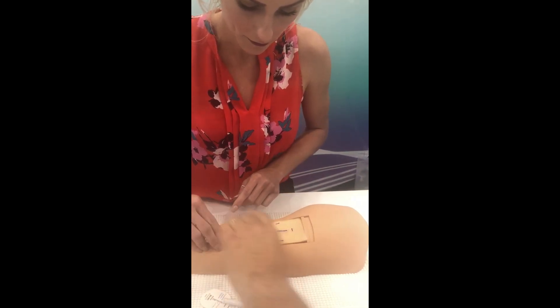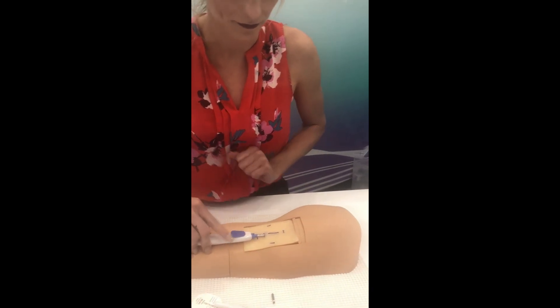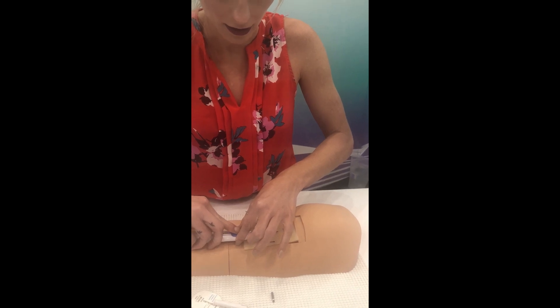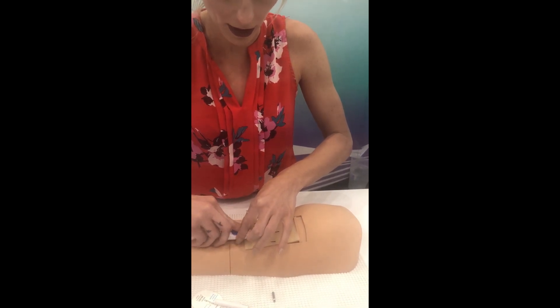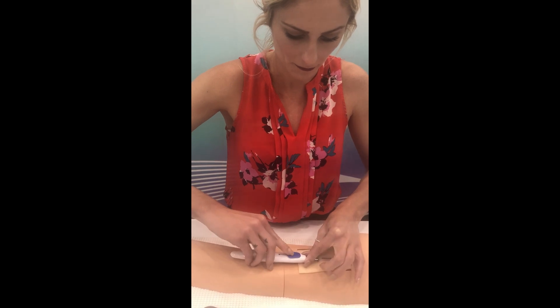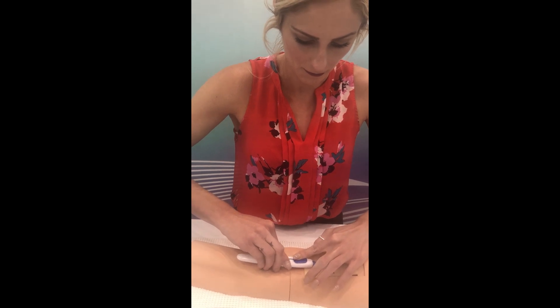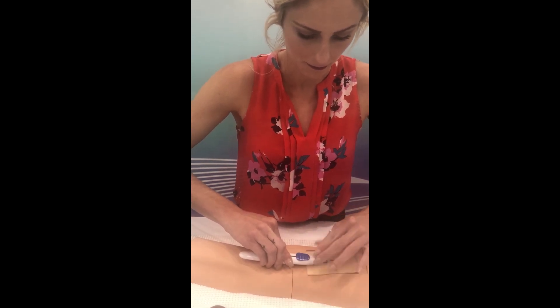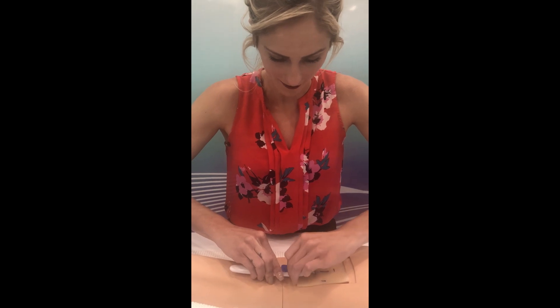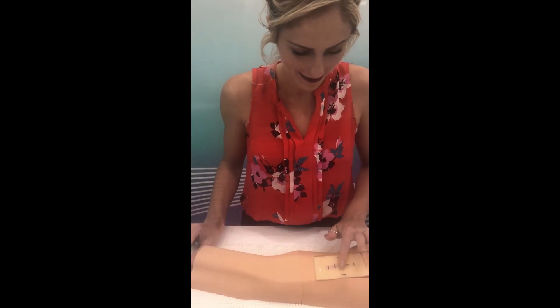Use your index finger. Whole hand here — this hand. You've got to support it like this. Support it with your other hand. And then pull back here. I did what you were talking about. So support it like this in the front and use this finger to press — index finger. Push it back. There you go. That was the hardest part. You didn't release it — now you've got to release it. There you go. Oh, it's in there! There it is!